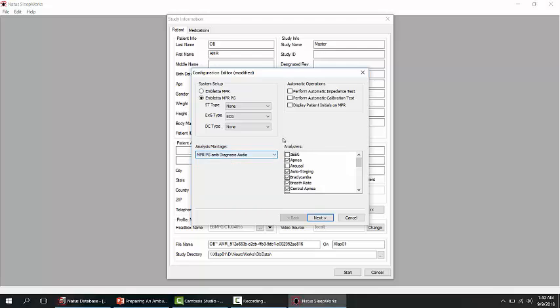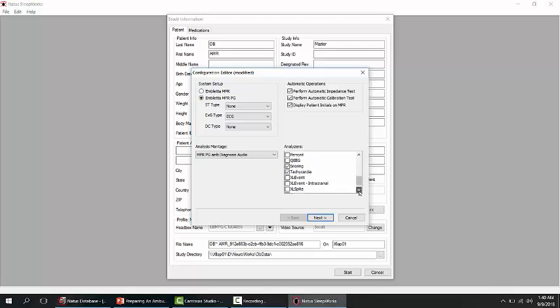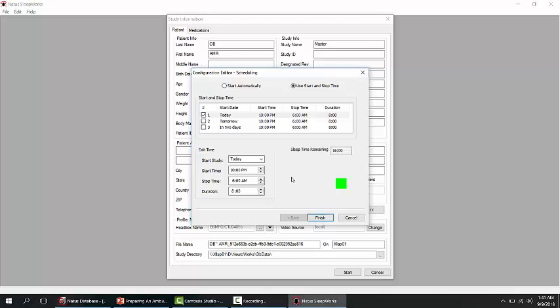Under automatic operations, you can choose to run automatic impedance and automatic calibration, choose whether to display patient initials, and modify the analyzers — for example, if you want to also include arousal analysis. You can drop down and select what you want, then click Next.